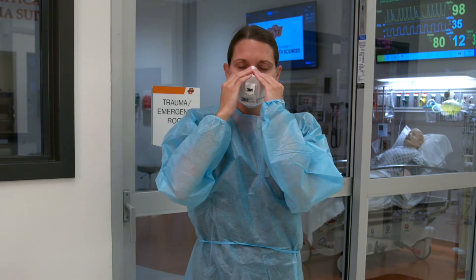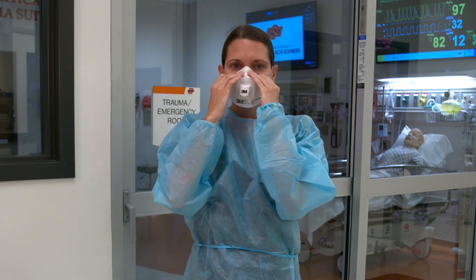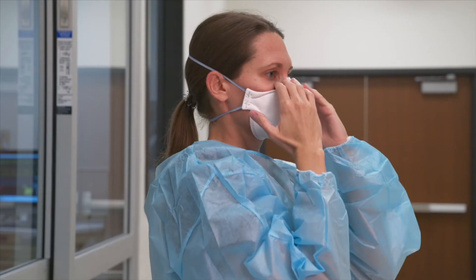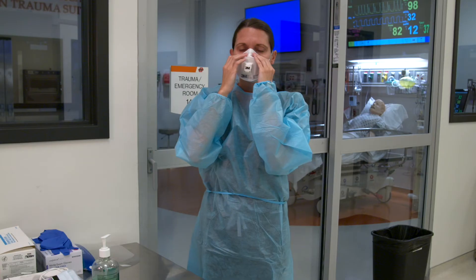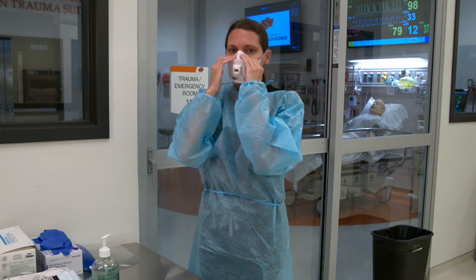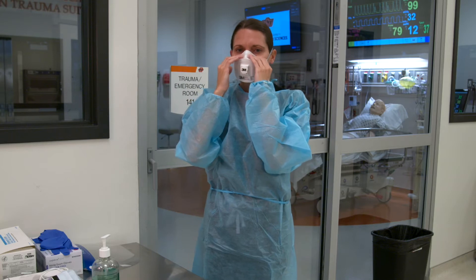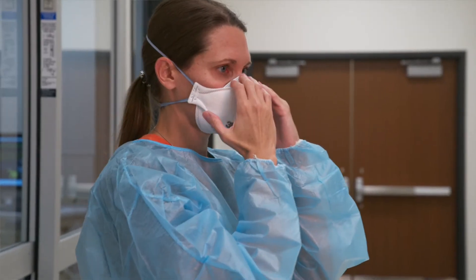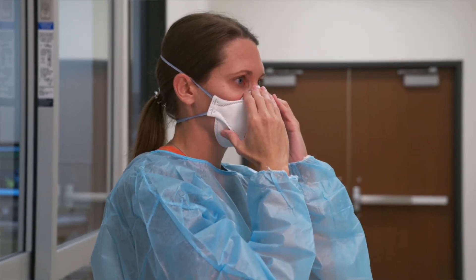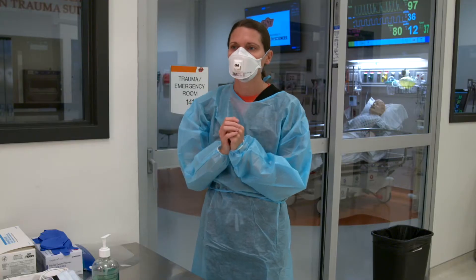Lastly, perform a user seal check. Use your hands to cover the surface of the respirator and gently exhale, checking that the face piece bulges slightly. Then, while keeping your hands over the respirator, take in a quick deep breath, checking that the face piece collapses slightly. If air escapes through the edges, readjust the fit of your respirator and perform another user seal check. Do this each time you put the respirator on.